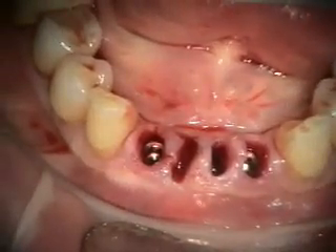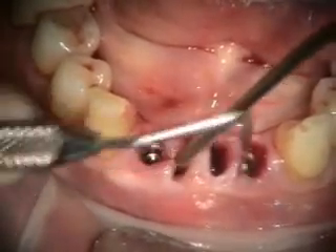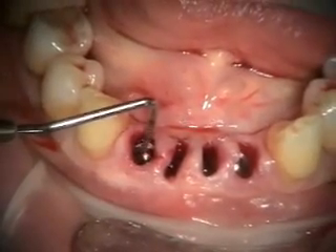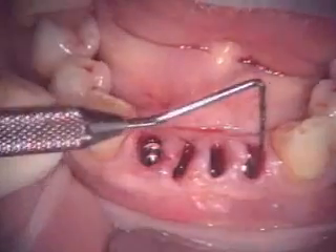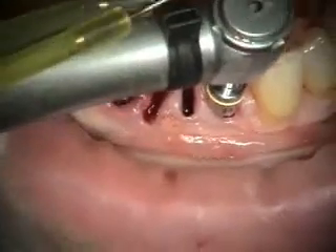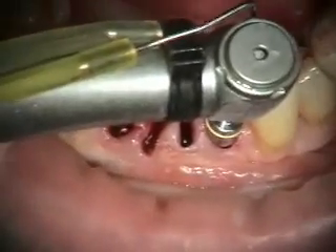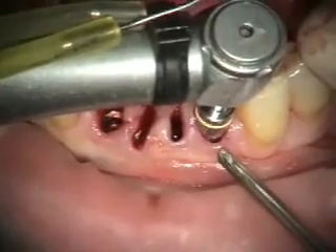We've got our implants leveled at about 3 millimeters on the facial, subgingival, which I think is going to be a good distance for achieving the emergence profile that we want. Now we're going to profile the bone. We've got our guide in the implant and we're going to be profiling the bone. We normally like to start out in reverse just to get past the soft tissue — all the soft tissue is kind of loose here.